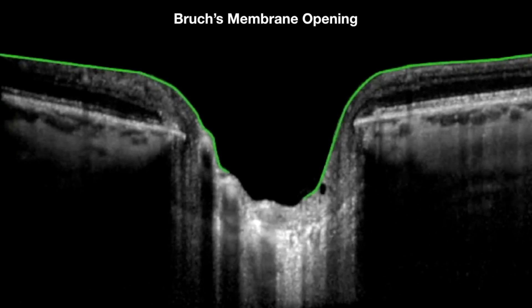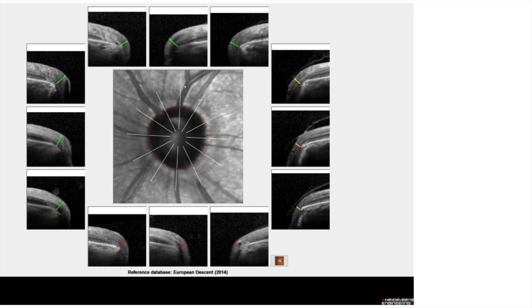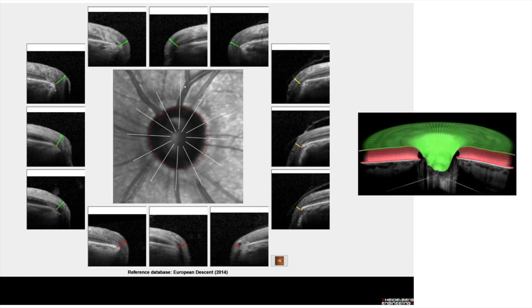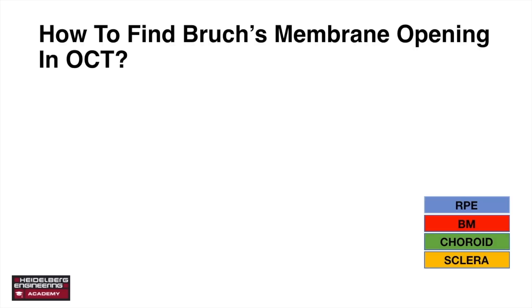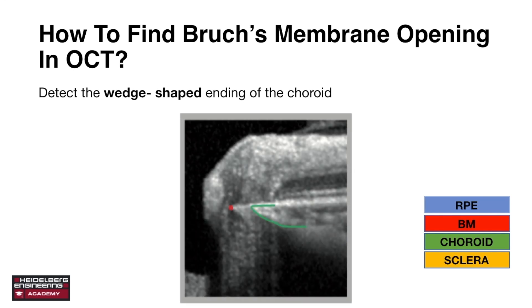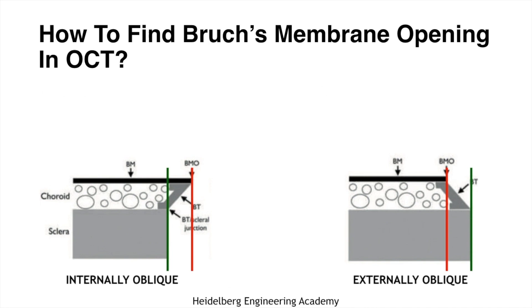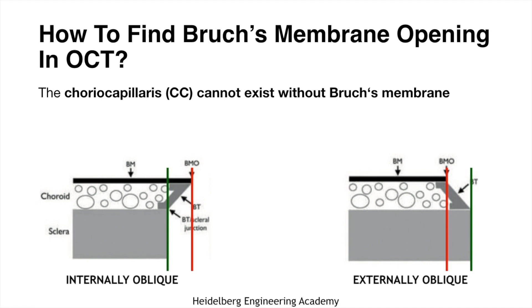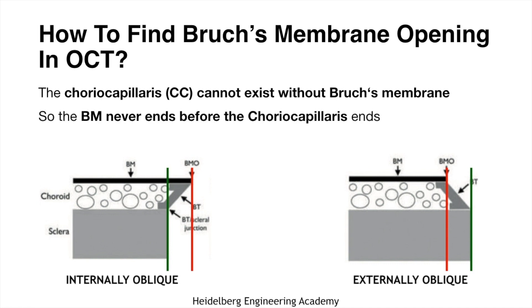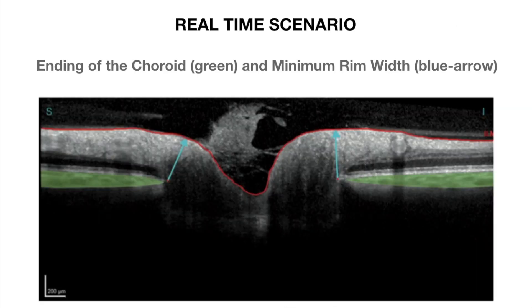The green line represents segmentation of the internal limiting membrane. The red line segments Bruch's membrane, with the Bruch's membrane opening depicted as a red dot. The 360-degree scan of the optic nerve head with BMO is shown. To find the BMO in OCT: first detect the green wedge-shaped ending of the choroid — BMO will be seen just adjacent to it. Bruch's membrane never ends before the choroid capillary's ending, whether internally or externally oblique, but can extend further than choroid capillaries. The ending of the choroid is shown in green and the minimum rim width is shown by the blue arrow.